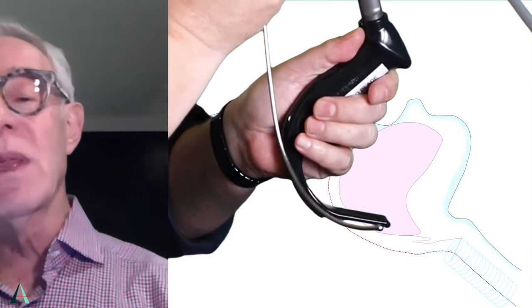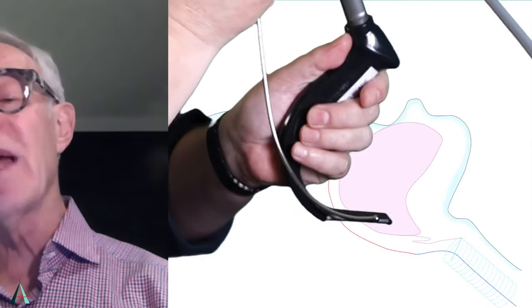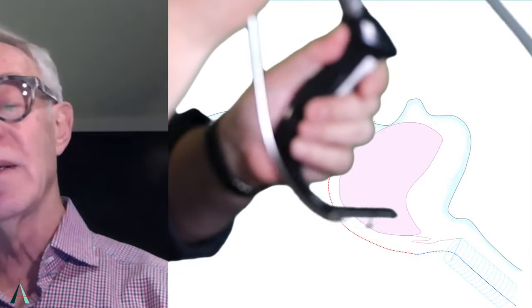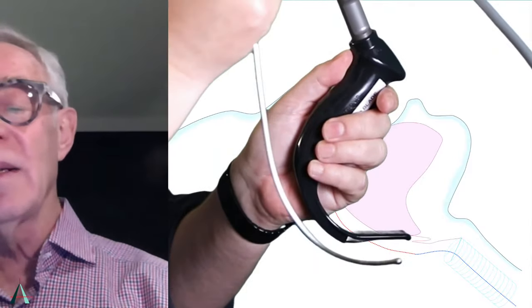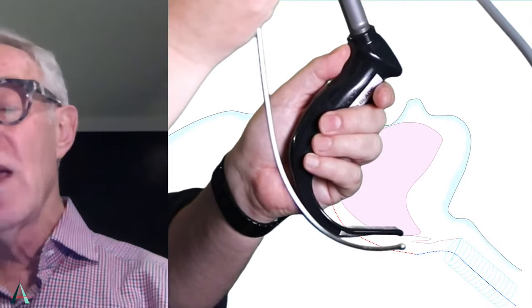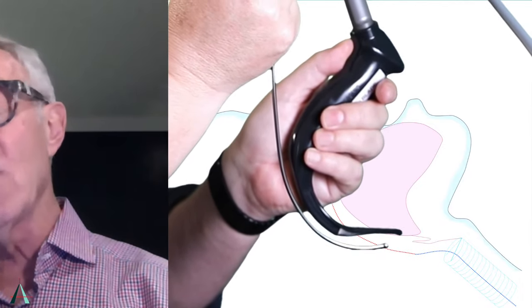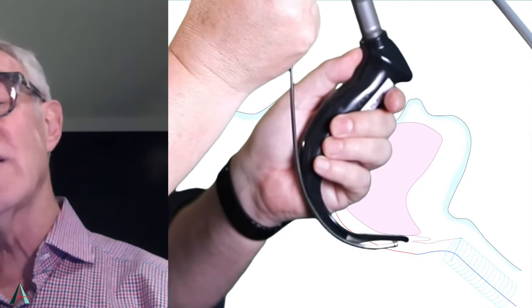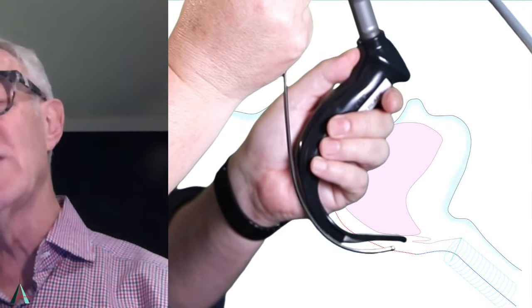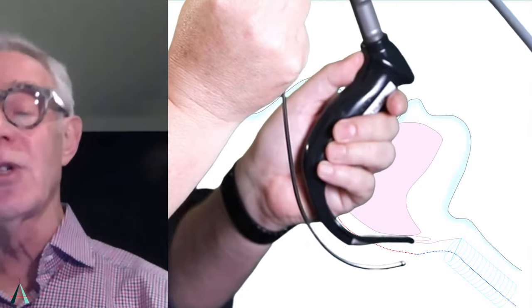So now what you're doing with the left hand, and we'll show it better within the mannequin in just a little while. If you can just drop your left hand a tiny bit, the left hand will actually be lifted a little bit. And the right hand, we're going to position it proximal to the larynx and right in the middle. We'll see that better from inside the mannequin. But the right hand maneuver is very simple. All you're doing is elevating with the right hand. So just lift slightly with a little bit of tilt, maybe 10 or 15 degrees upward. That's it. Good. And that will put the endotracheal tube right at the laryngeal orifice.